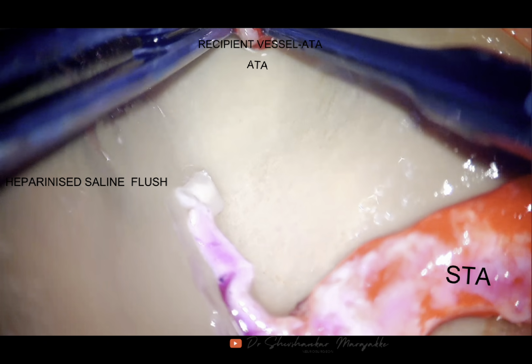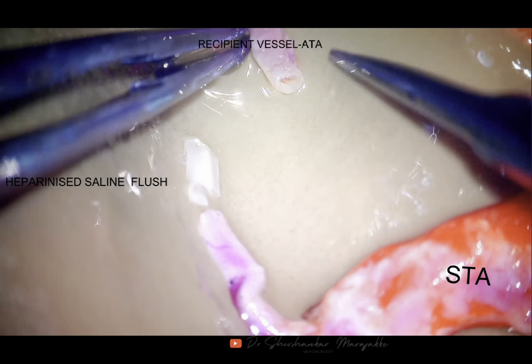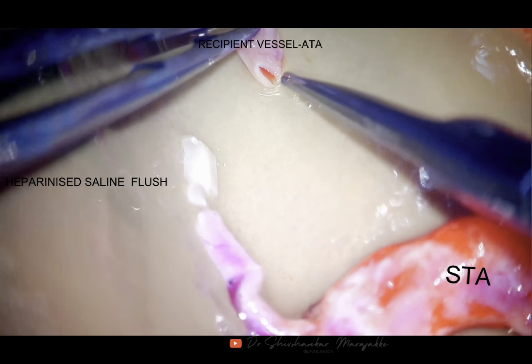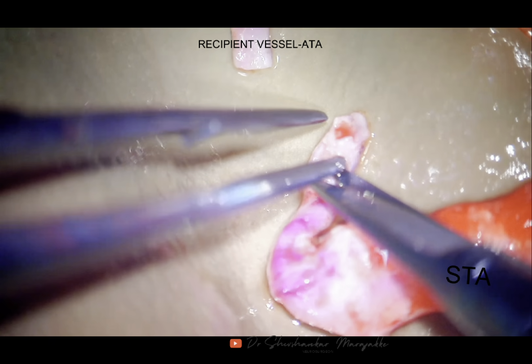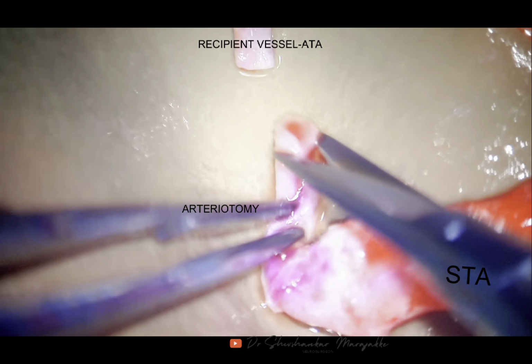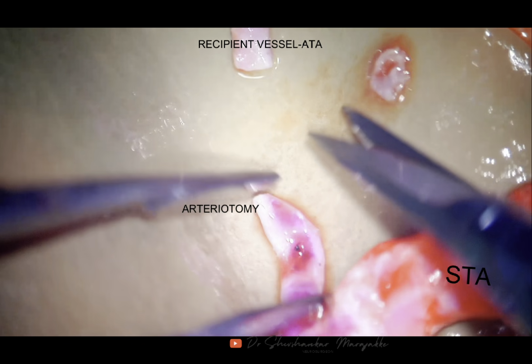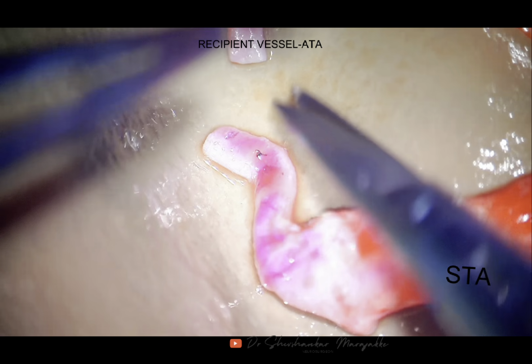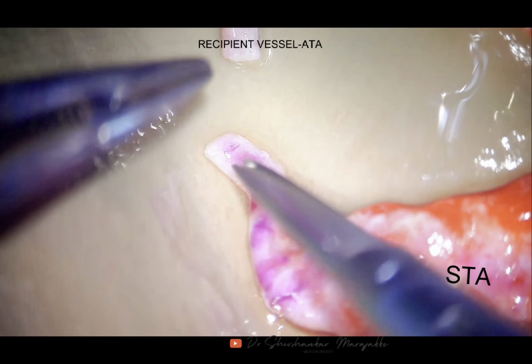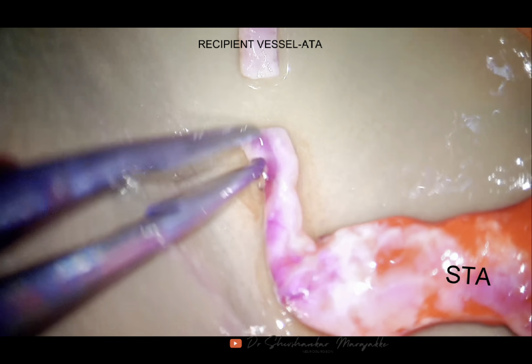Herein you can see the lumen is okay, because if it is calcified, the intima will separate, and that will once again cause thrombus, and even the sutures might cut through. After this, we did a transverse arteriotomy so that the ends are parallel to each other, and we can go ahead with the end-to-end anastomosis. So we are okay with the surface orientation here.